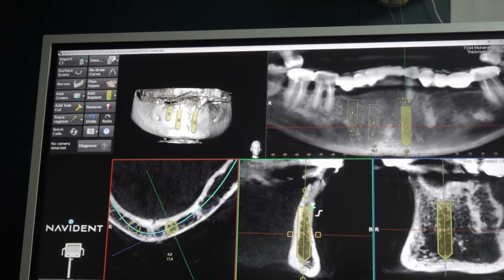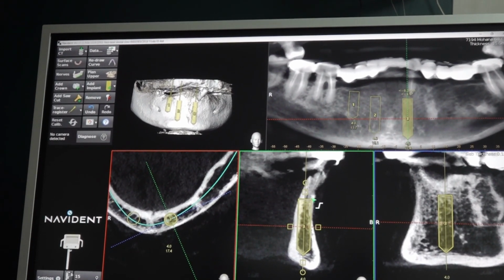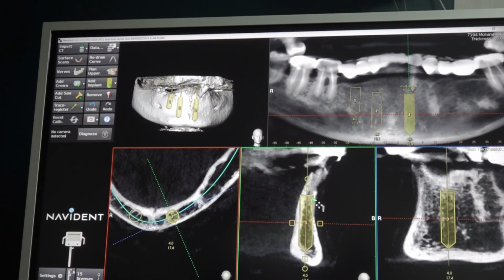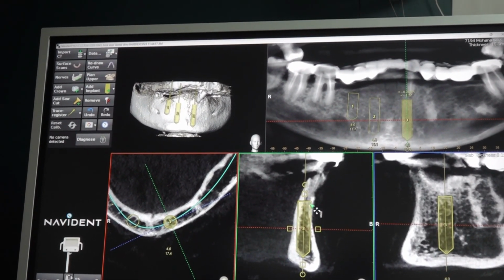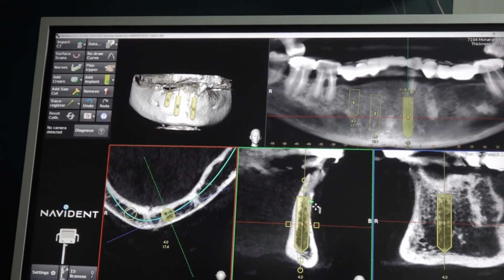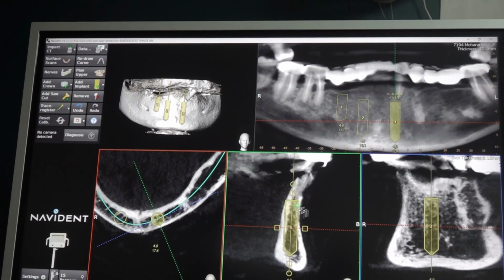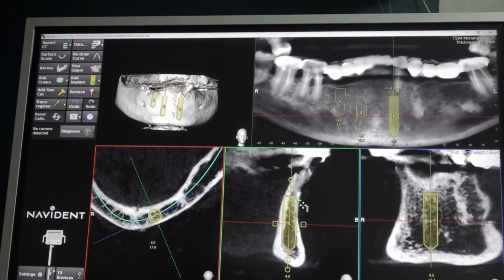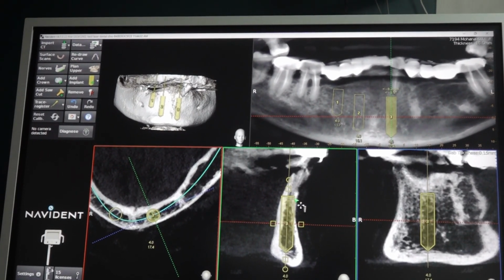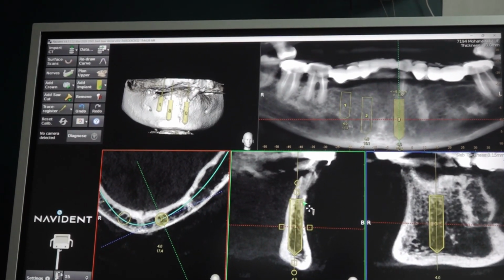The advantage is the top crestal few threads are smooth surface. So even if some bone resorption is happening because of the thinness, it is not an issue. But if it is a totally rough surface from the crest, and there is some bone resorption after 2 months, 3 months here, then it's not good. So the top few threads are smooth surface. Have you seen? No. Okay. Next one.